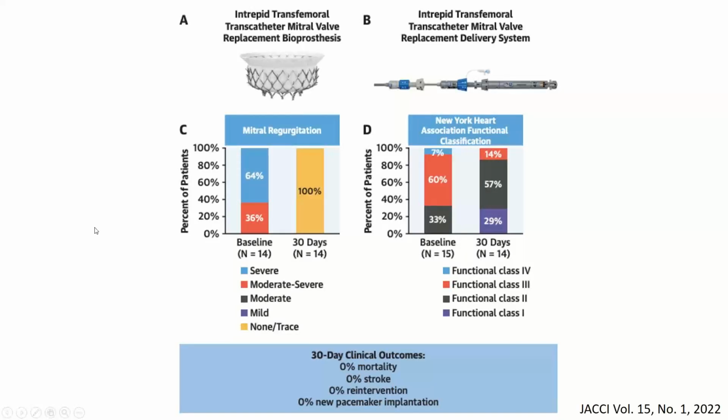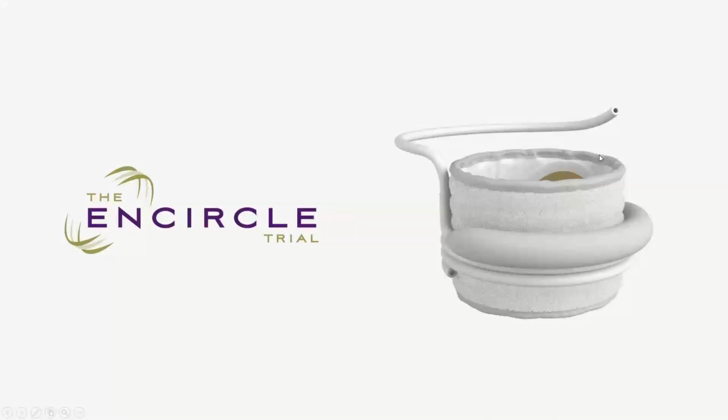So one possible option is to try the Intrepid valve developed by Medtronic. This is their early feasibility study of 14 patients, and you can see that in this particular valve, they were able to obliterate mitral regurgitation, with early data showing improvement in NYHA functional capacity with zero risk of mortality, stroke, re-intervention, or pacemaker implantation. The problem is the device currently is not available in Canada, and this is still true today.